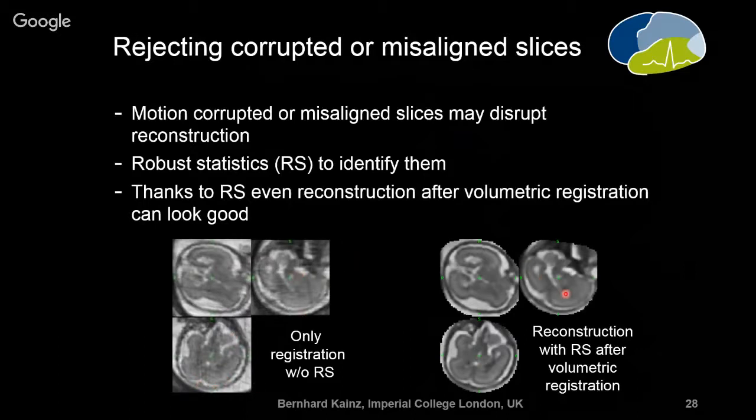But if you do it with automatic outlier rejection, you will lose quite some data, but that's why we do a highly redundant data sampling approach, and if we have enough data, we can afford to throw away 30–40% of our acquired slices. So if you do that and just leave the very reliable ones, our results are actually quite good.